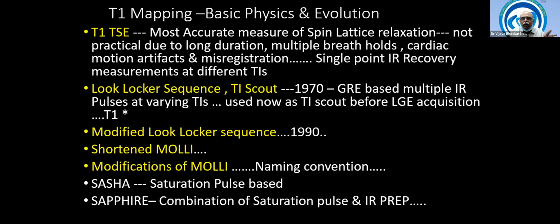Number three, in the modified Look-Locker sequence, there is a motion correction known as non-rigid registration of the data.